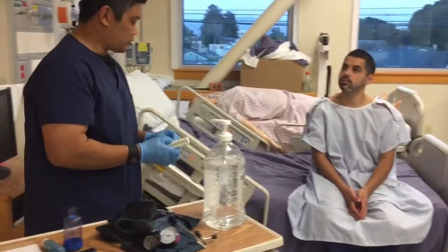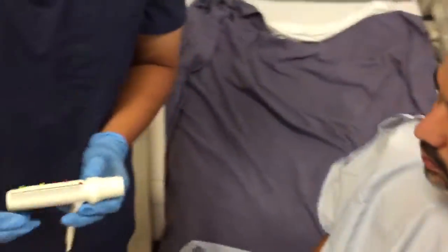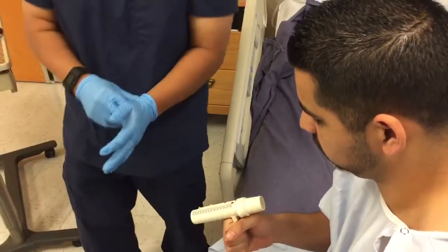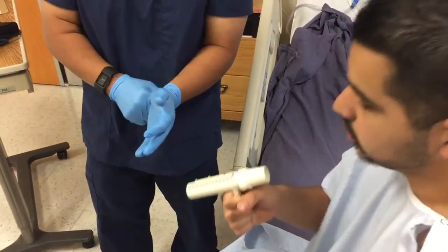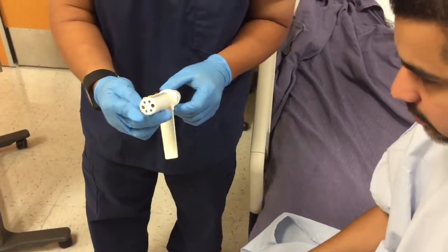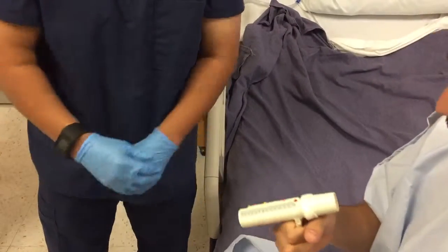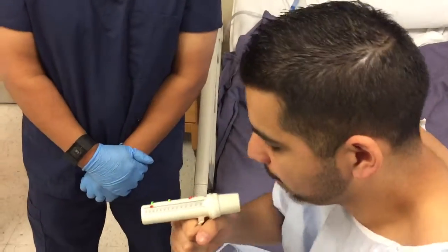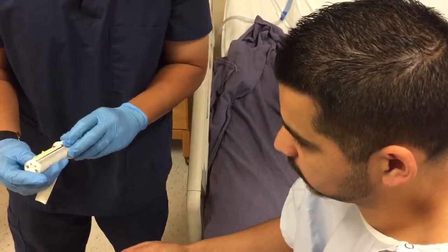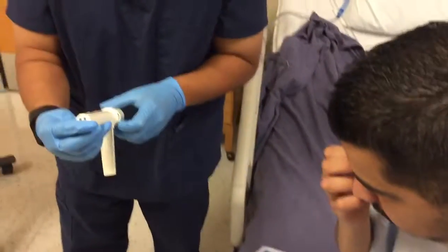And we'll do this first. It's the flow meter once more. We already have it set for you. Go ahead like before. Take a deep breath in and exhale as strongly as you can. All right, it's not bad. So go ahead and we'll do it two more times. All right, very good. And one more. All right, thank you.